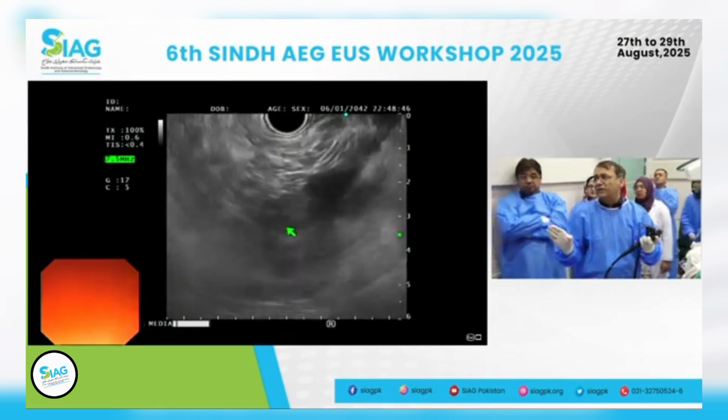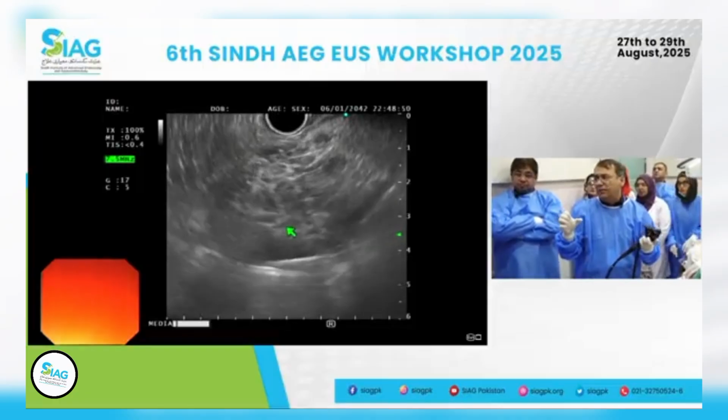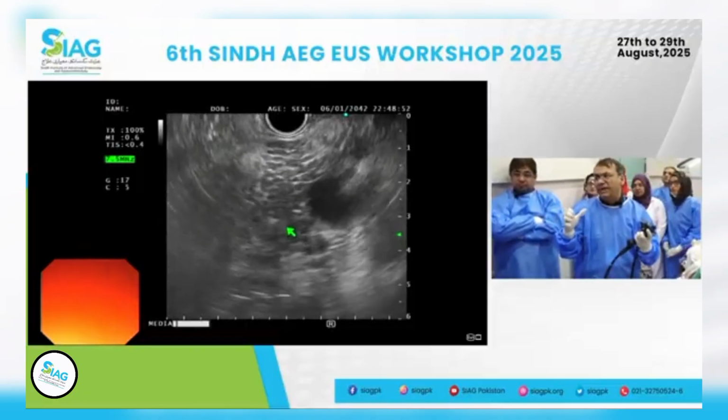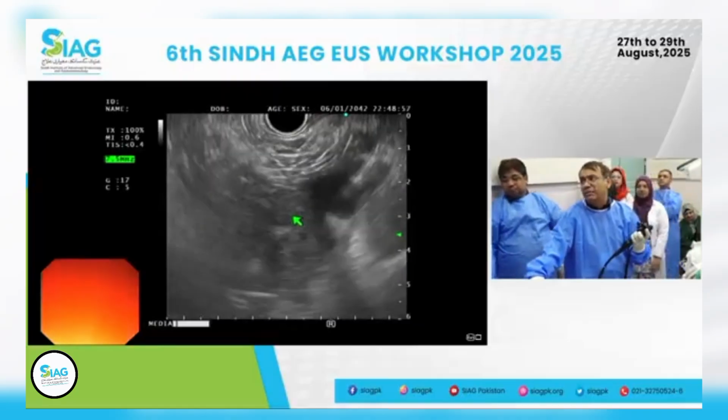This is interesting because even though there are some changes of chronic pancreatitis, post-obstructive, it's not causing a pancreatic duct dilation, which is okay. And I think it possibly could be a metastatic.